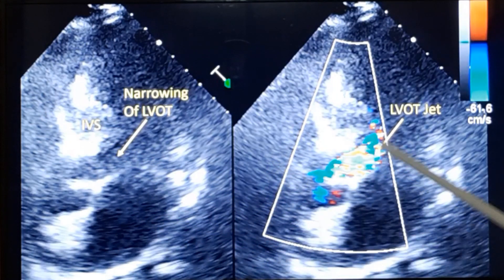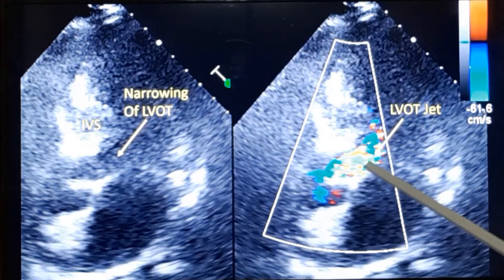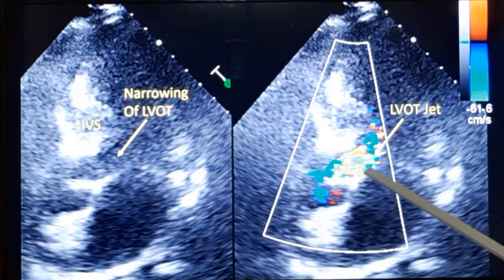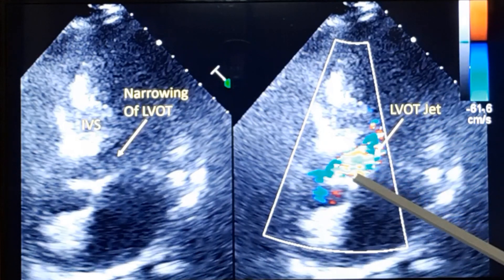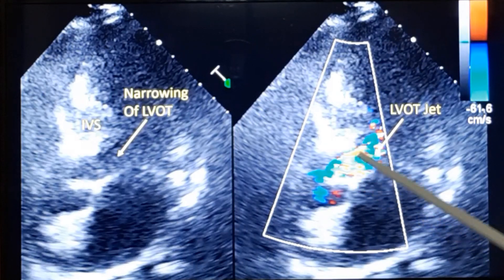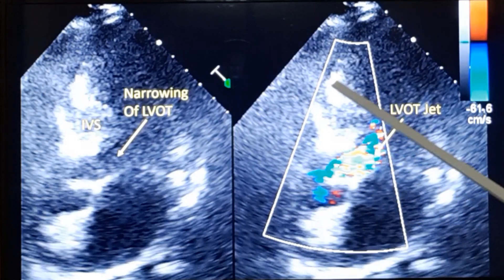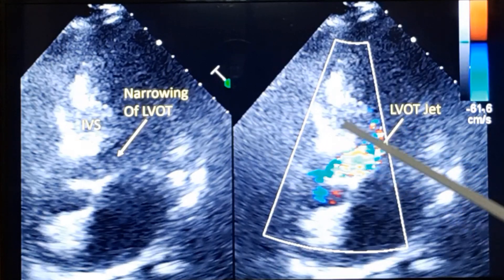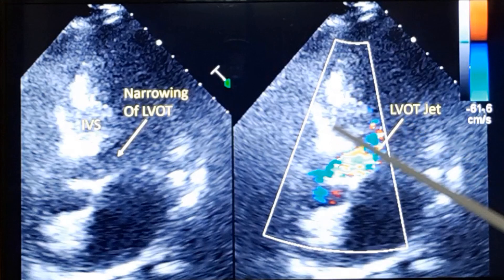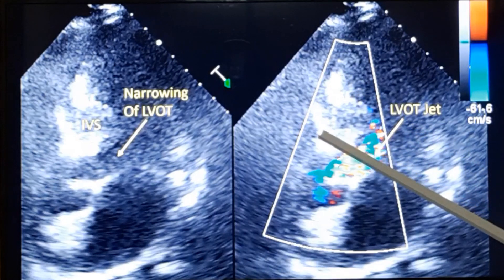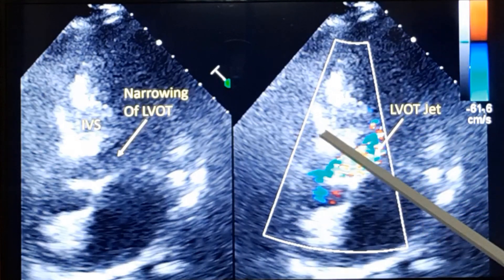Here you can see color Doppler in which there is a turbulent multicolored jet going across the left ventricular outflow tract. This will produce a gradient in the left ventricular outflow tract. You can also see that the echo texture of the septum is not uniform — the speckled appearance is also part of hypertrophic obstructive cardiomyopathy.